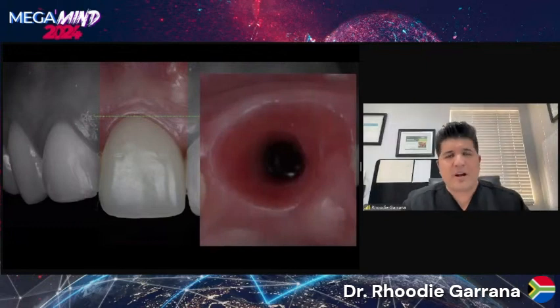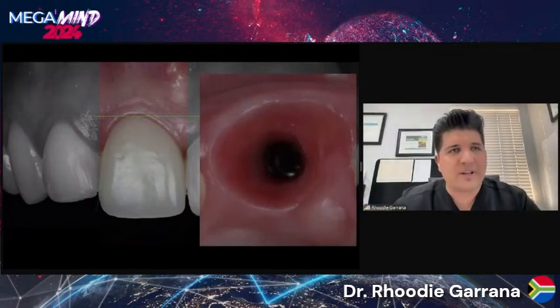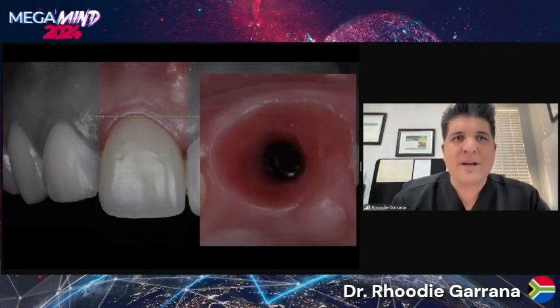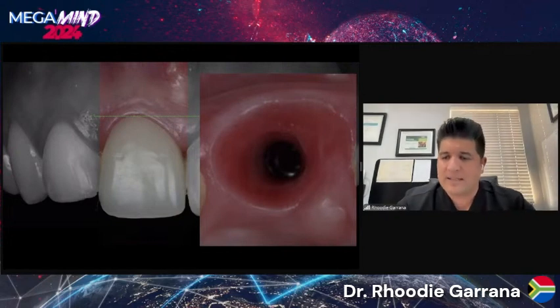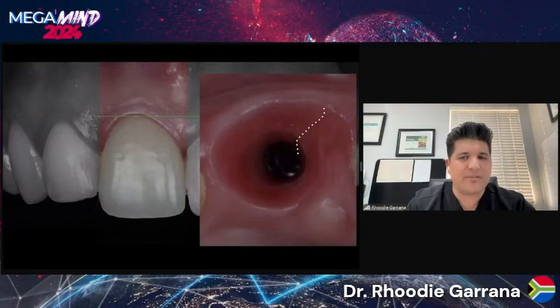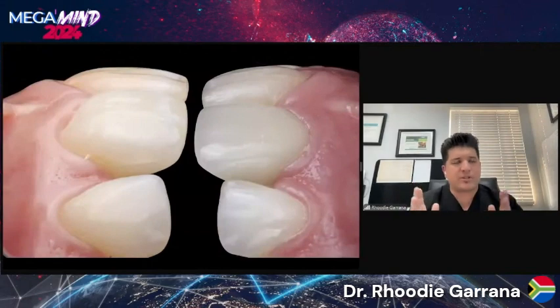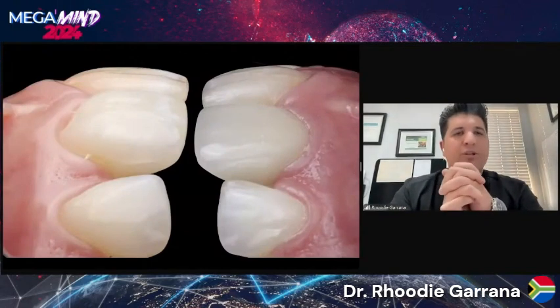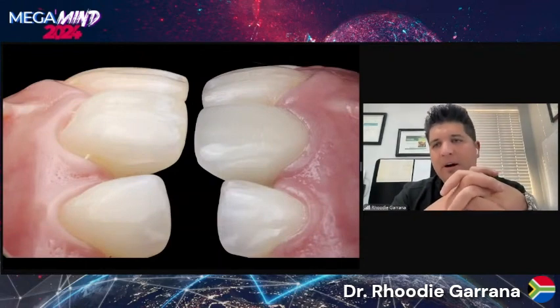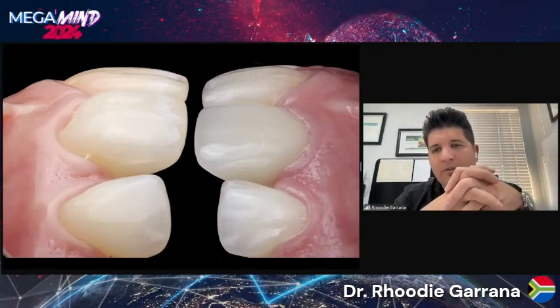Once removing that crown, one can argue, should we be removing crowns and replacing crowns on and off all the time, breaking hemidesmosomal attachment? Potentially not. However, I did remove the crown at this point, and we can see a beautiful S-line curve, and we can see the soft tissue filling in that S-line curve very, very nicely. And so this is just a mirrored image showing the case on your left-hand side before, and a mirror of the implant crown on the right.